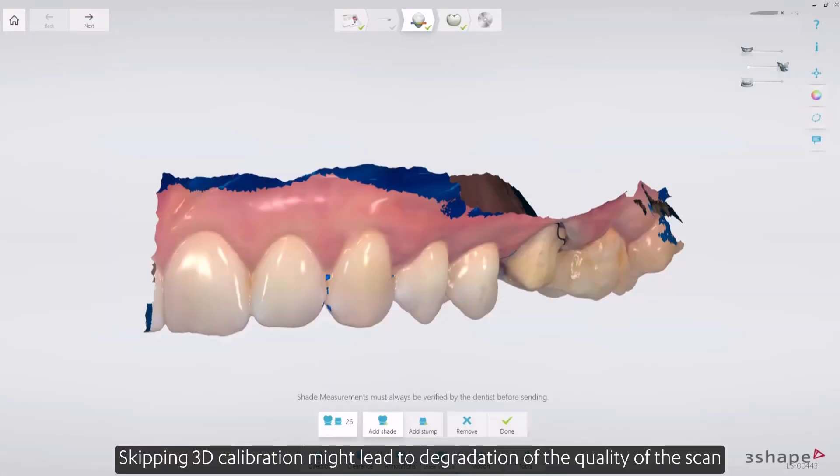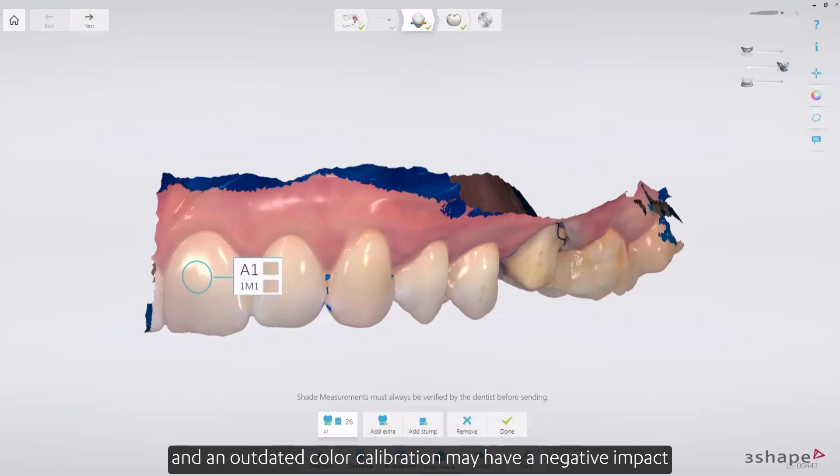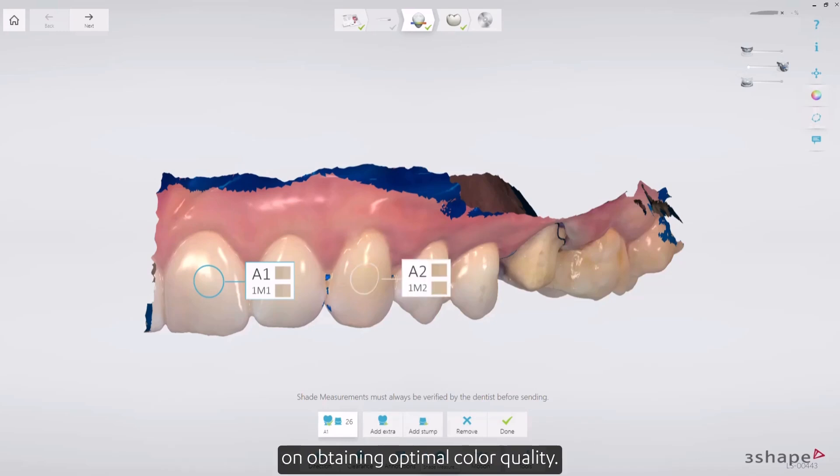Skipping 3D calibration might lead to degradation of the quality of the scan, and an outdated color calibration may have a negative impact on obtaining optimal color quality. Shade measurement will be disabled if color calibration is not performed for 30 days.